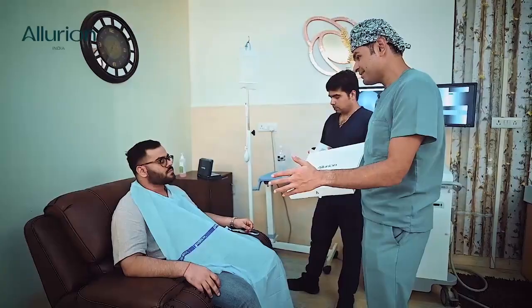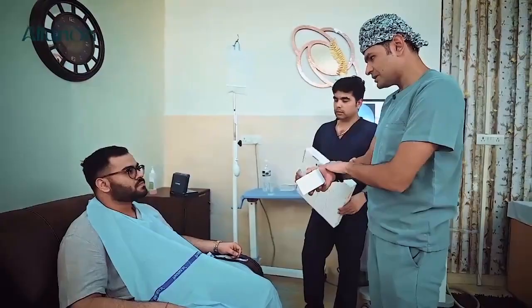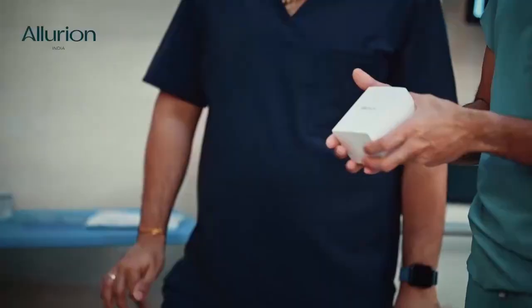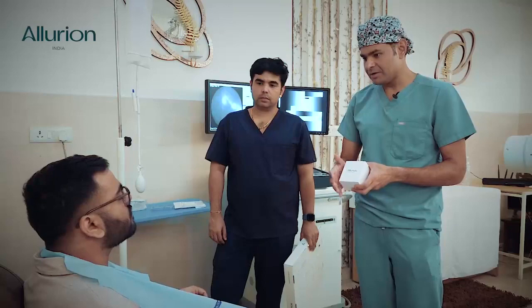The scale includes your body mass index and your body composition analysis, which includes your body fat percentage and your muscle mass. We'll also give you this health tracker to be worn on your wrist just like a watch, which lets us know about your progress in terms of weight loss, increase in activity, and fitness.